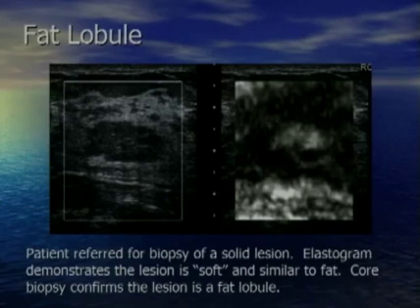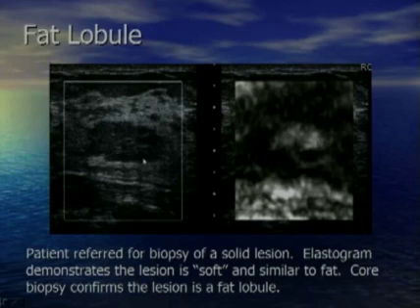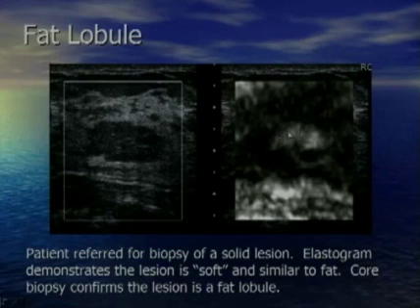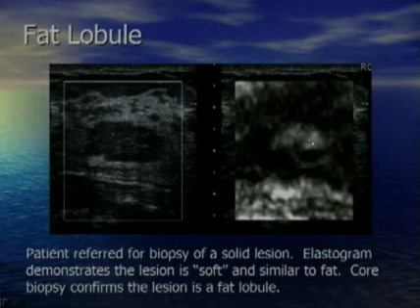This first example: a patient referred to us because a hypoechoic lobular mass in dense breast tissue was referred for ultrasound-guided biopsy. When we did the elastogram, it showed an extremely soft lesion with similar hardness to other fat in the image — it's actually just a fat lobule and does not need a biopsy.